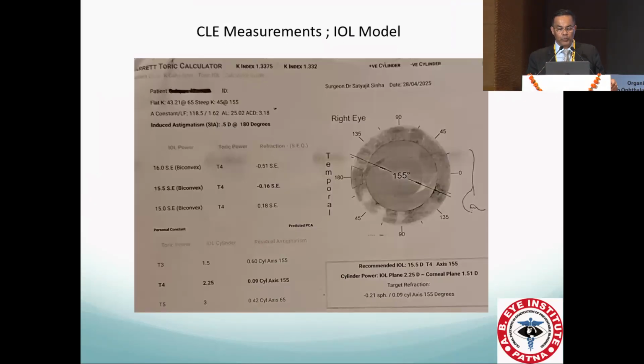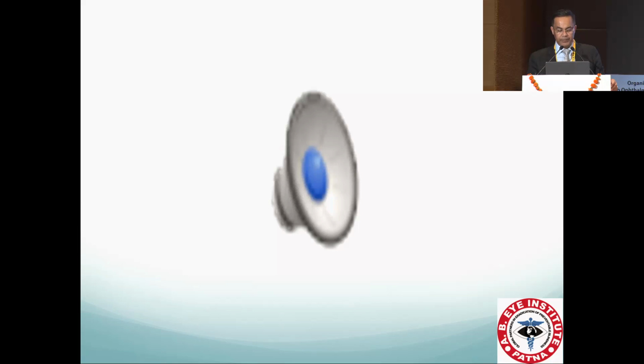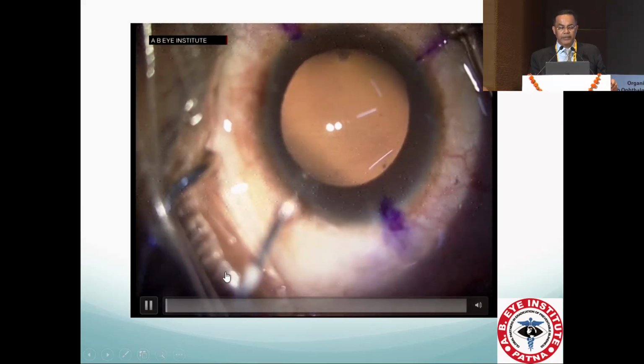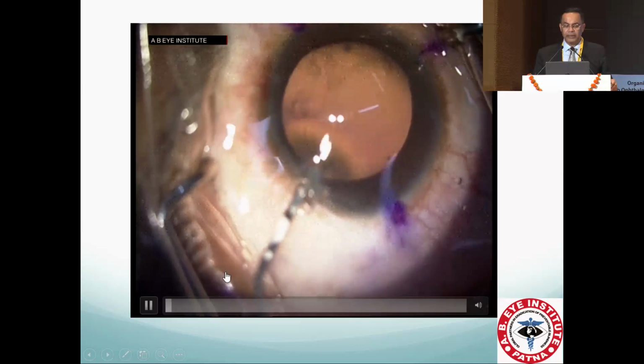So this was her topography, and I was putting a toric trifocal intraocular lens. So this was the alignment, and this is the video for the clear lens extraction.